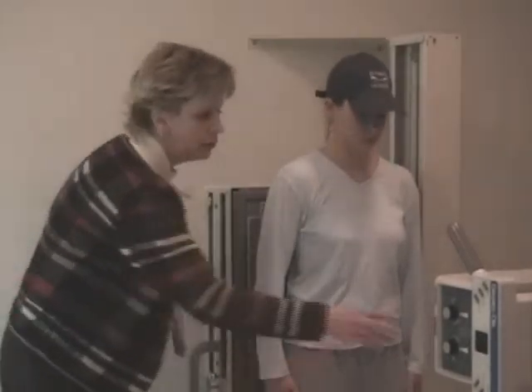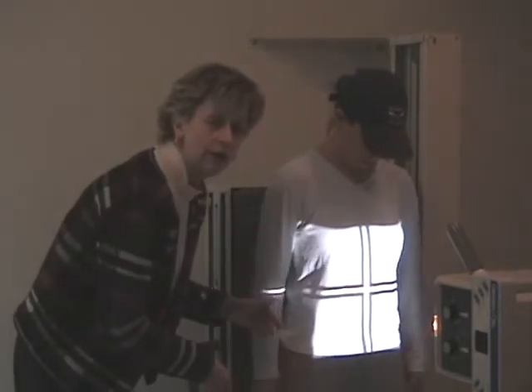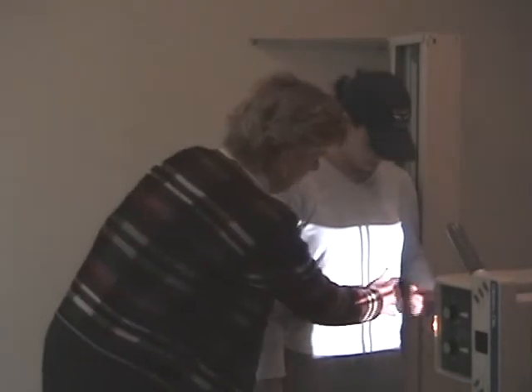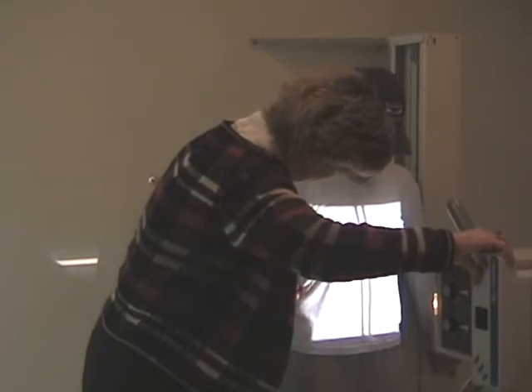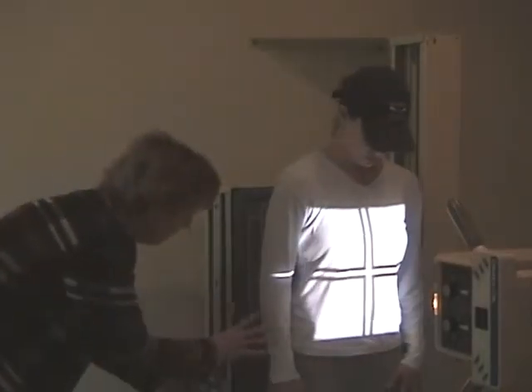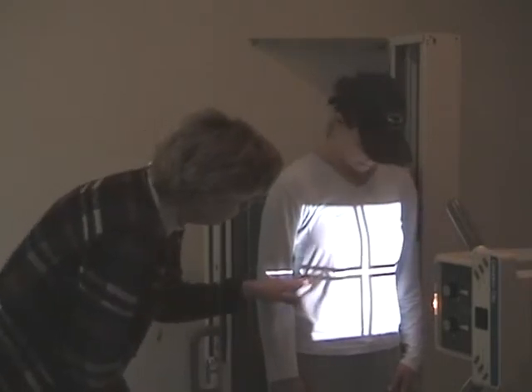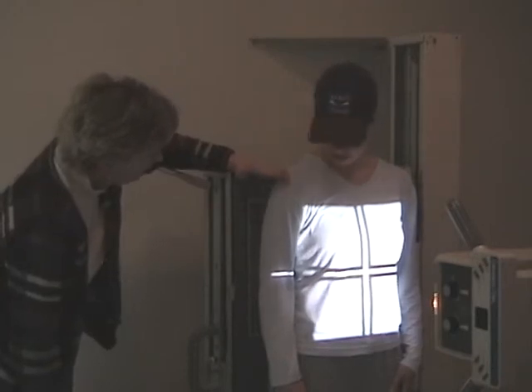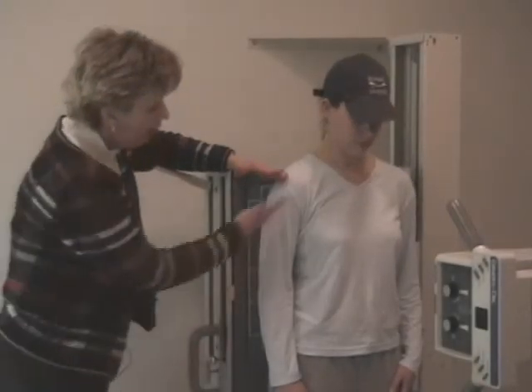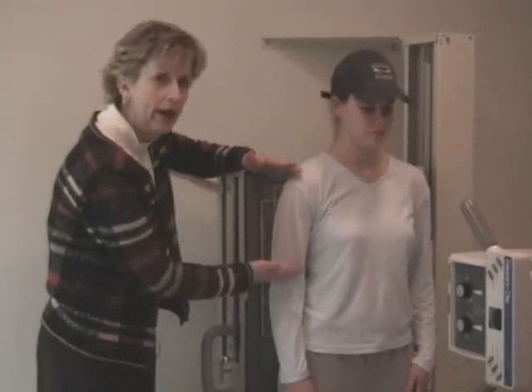I'll try to mock this with Drea, though, because I don't want you to take for granted that you should center higher than the crest level. But let's say you did take that for granted, and we're just going to center 2 inches higher than the crest to the center of the film. Okay, the center of the film is now 2 inches above the crest. Take a look at the top edge of the film on Drea as our patient. And how much lung are we going to include? I want you to think about that.